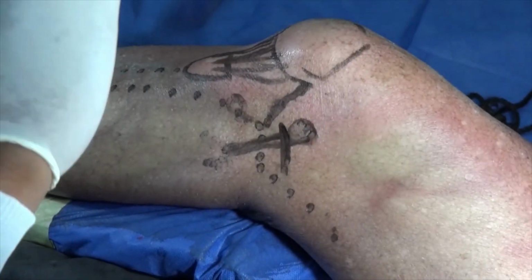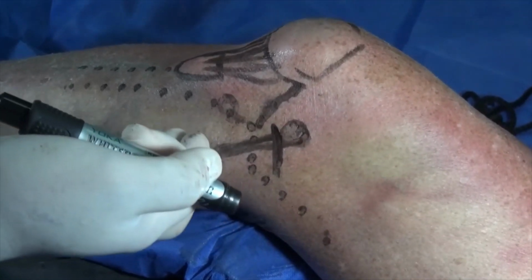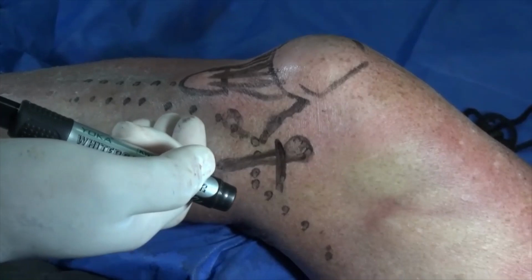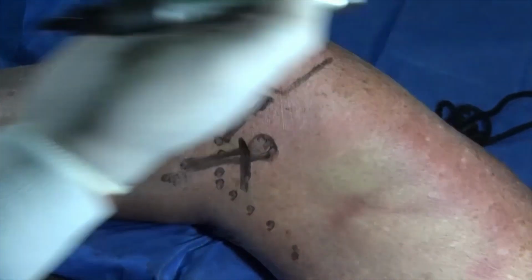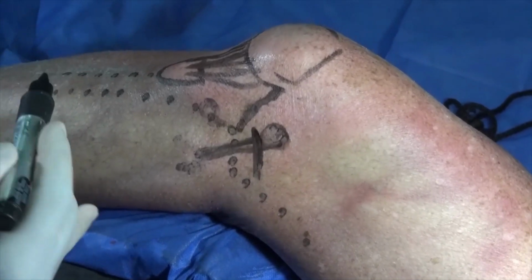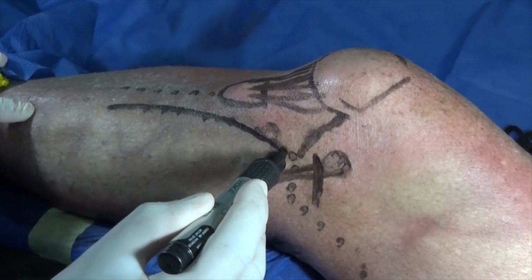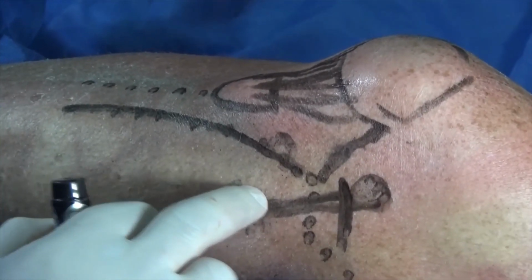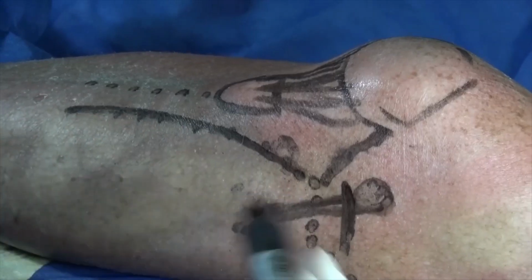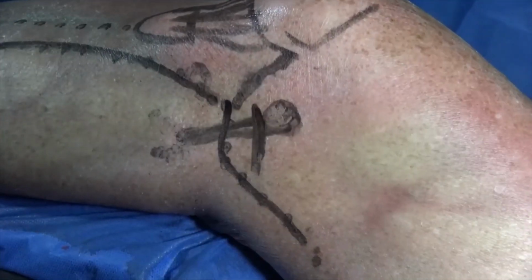So you've made a decision when you're starting whether you need just an anterolateral approach or whether you may need to extend it posterolaterally to capture that posterolateral fragment, or if you think the fracture is going slightly more posterior than a true posterolateral fragment. Depending on that, your incision will change from this here to one that may go more posteriorly towards your fibula head. But we'll start with this, and then you can always curve it like this for the extension.